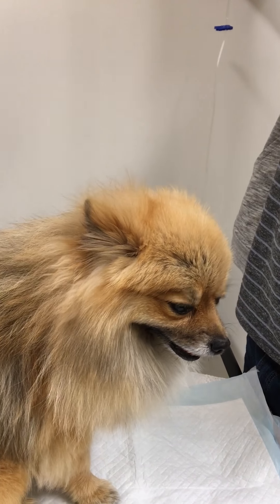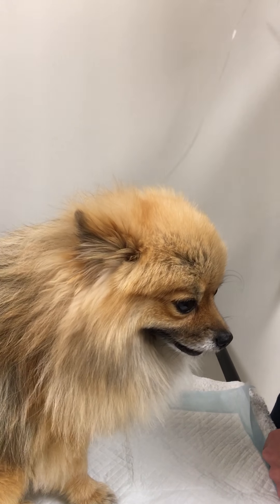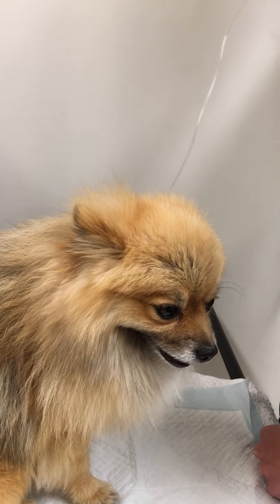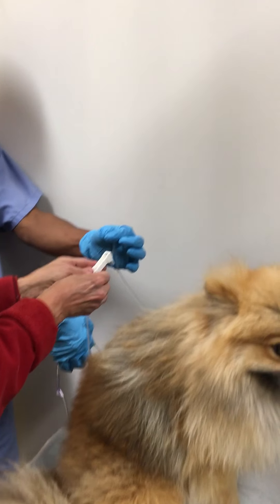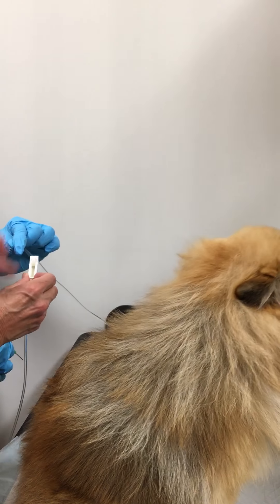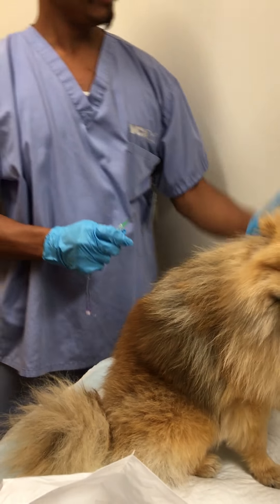There's like a two-lock device kind of thing. Two locks. If you don't want to use this one, that's fine. But as long as you have this one completely closed all the way down. I don't know how to even do this thing. So what do I do here? This goes this way to unlock? Yeah. And then this is all locked? Yeah. All the way up. That's locked all the way the other way? That's open. Correct. And then if I go out the other way, then it's locked. So we want to open now. It pinches it by going this way.